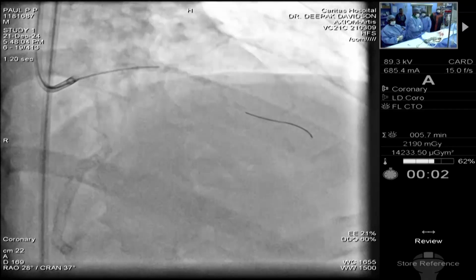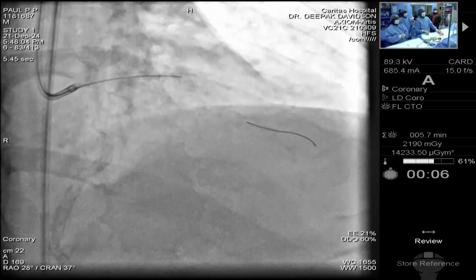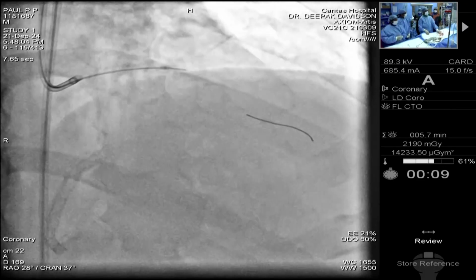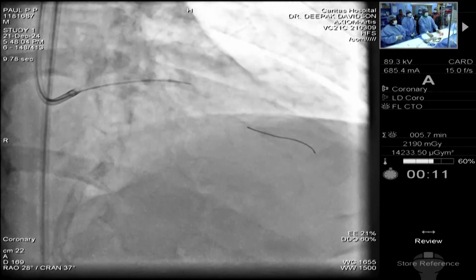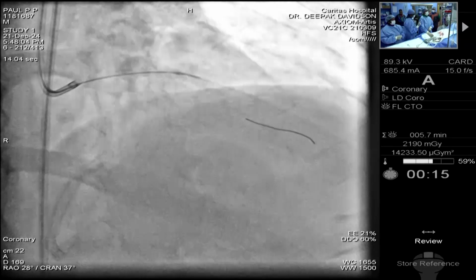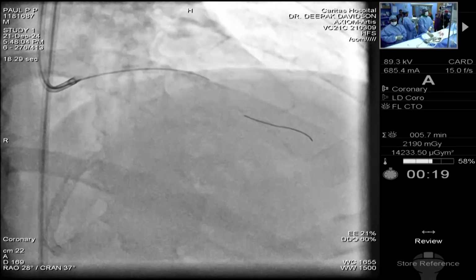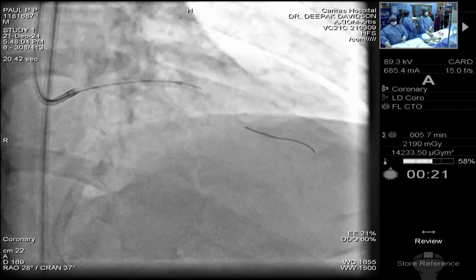Or should we go for one more run? No STT changes. One more. We can always do that. The problem with rota, while doing rota as well as while doing this thing.